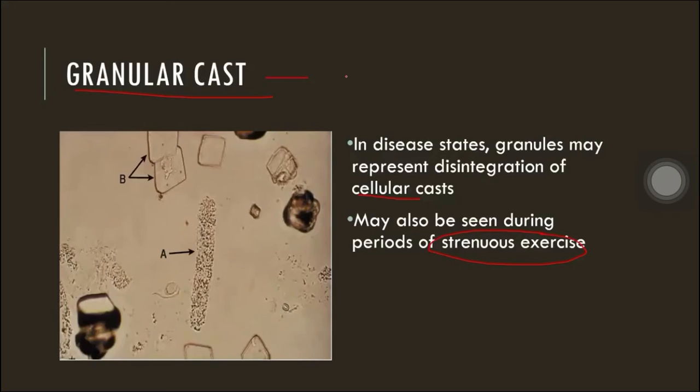Okay? So, kapag granular, after nun, kapag may extreme urinary stasis na talaga, sobrang lala ng kidney disease, kidney condition, okay, magiging waxy na siya. So, waxy denotes extreme urinary stasis. Okay, indicative of chronic renal stage. Okay, chronic renal kidney disease. Okay. Chronic kidney disease.